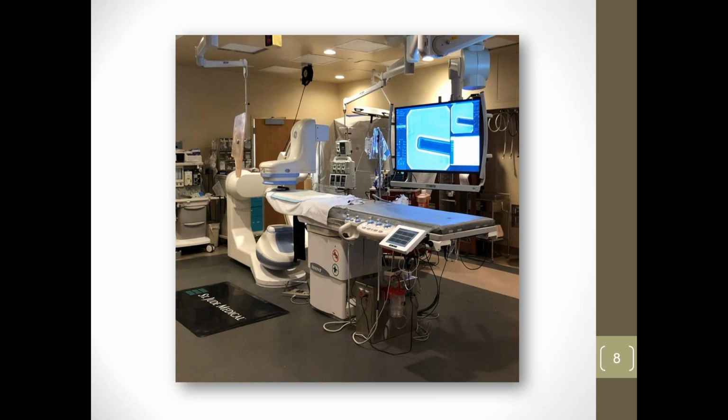So here's my calibrated stapler that I'm using as my phantom. So you can see that on a couple images there. Here is the image detector, or the flat panel detector. So this is what's actually making the images completely digital. And down here you can see the X-ray tube, and then the table. Again, hard to see. There's an anesthesia machine. You've got some catheters back in here. So a lot of moving parts and pieces go on inside the labs.